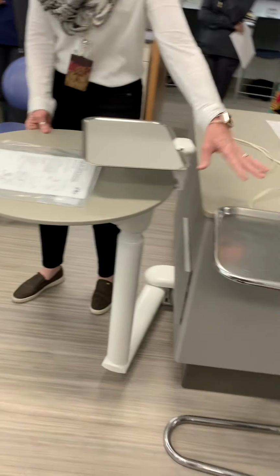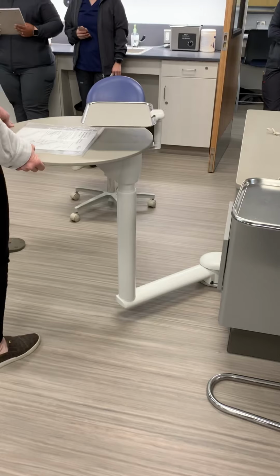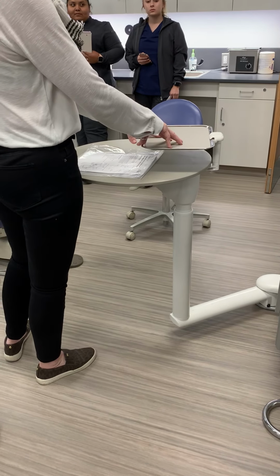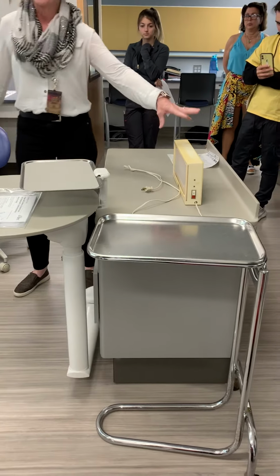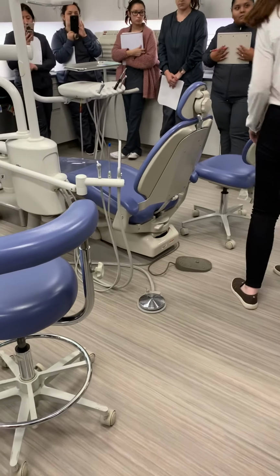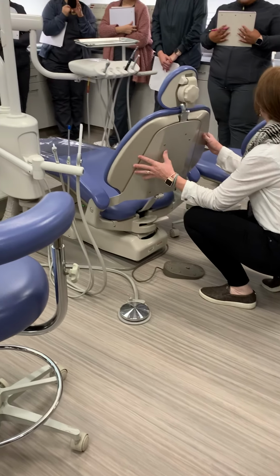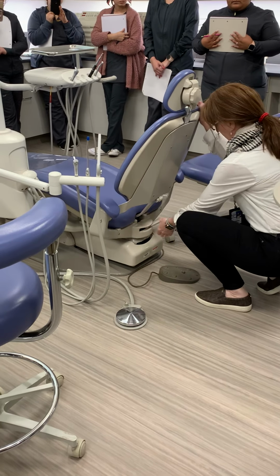Okay, this is our new Mayo tray. So it now is replacing this. Isn't this fabulous? Like it pulls out for you guys. You can mix your cements and stuff once you learn that. Your instruments can go here. This is your 12 o'clock unit where your computers and your supplies will go. So it's fabulous. And toggle switch if you need to move the chair, which we ask you don't use these, okay? This would be if we had, again, someone who's in a wheelchair or needs extra accessibility.